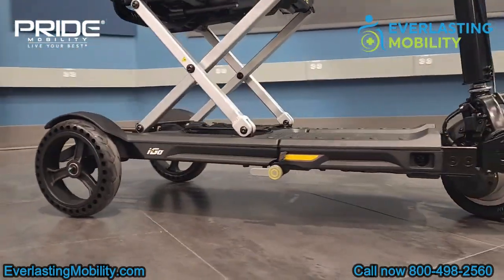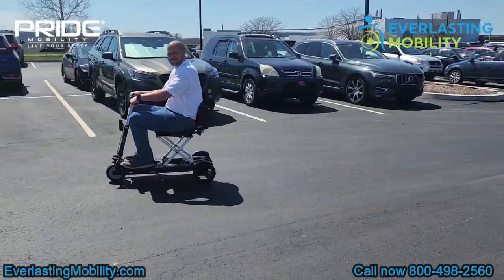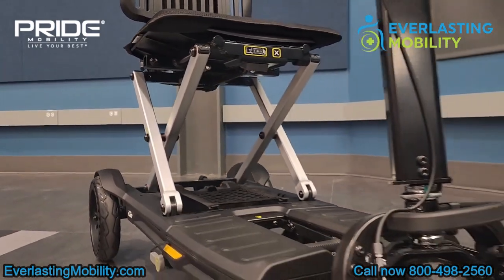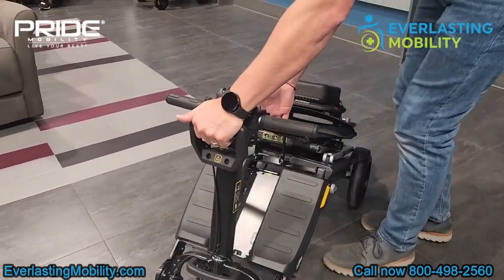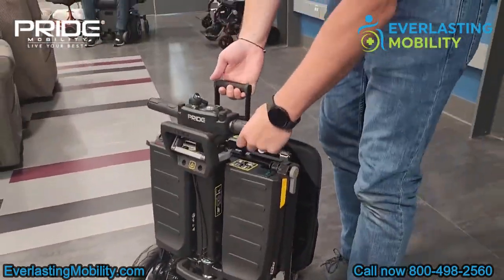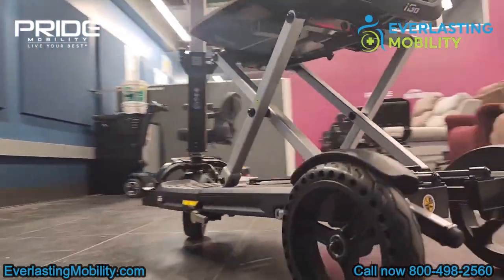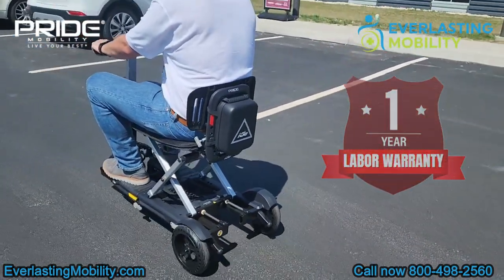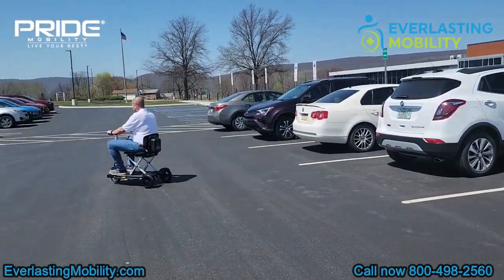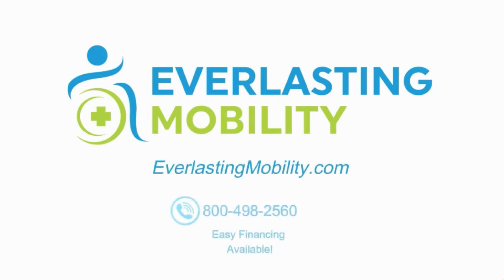In conclusion, if you're looking for a great folding mobility scooter that's approved for airline travel, can go on cruises, folds into one piece easily, and can be taken apart into two more lightweight pieces, the iGo is an excellent choice. It's made by Pride Mobility, a staple in the powered mobility industry with one of the best warranties in the industry, including one year of in-home service. As long as it's an approved warranty claim, they'll send a technician to your home to diagnose and resolve any issue within the first year. If you have any questions, call us at 1-800-498-2560 or visit everlastingmobility.com.